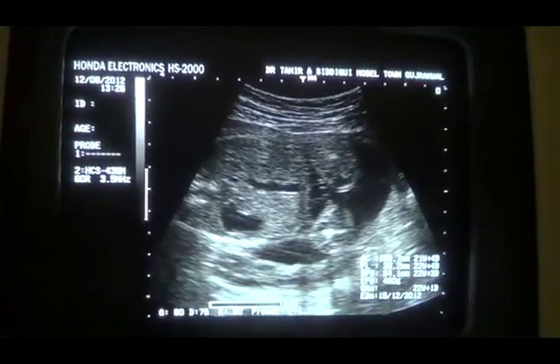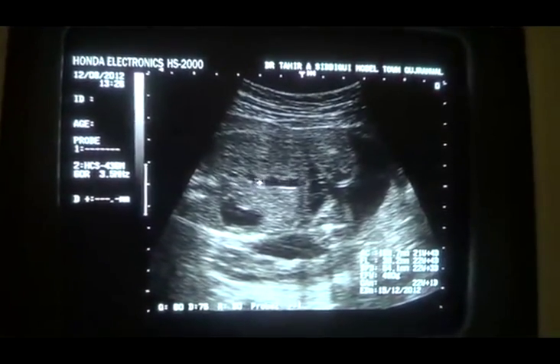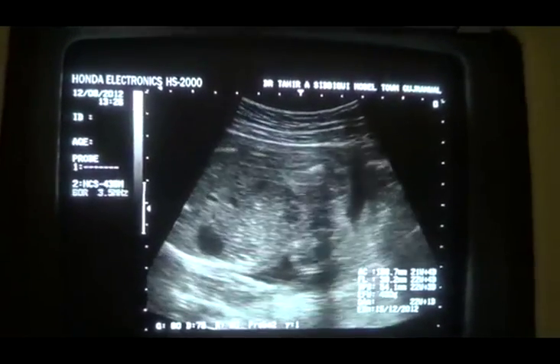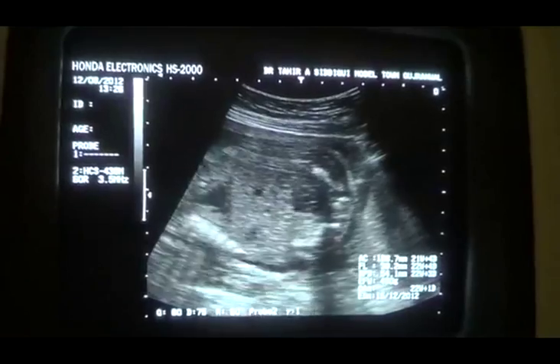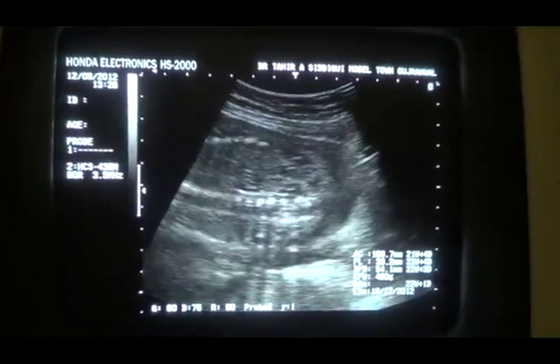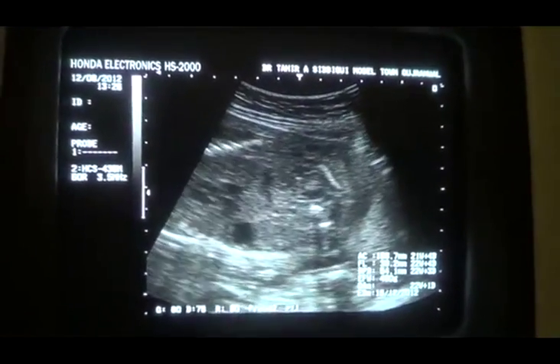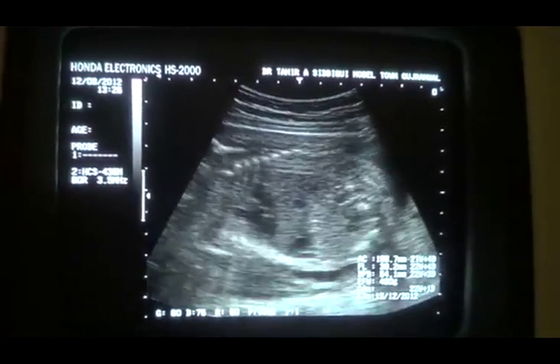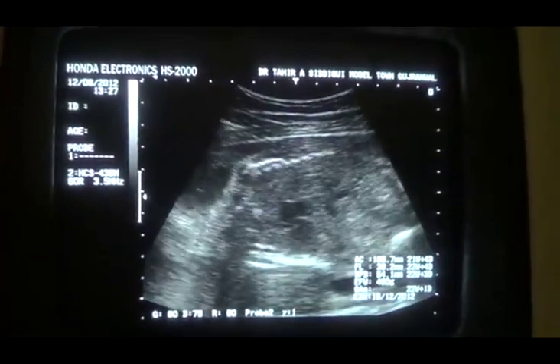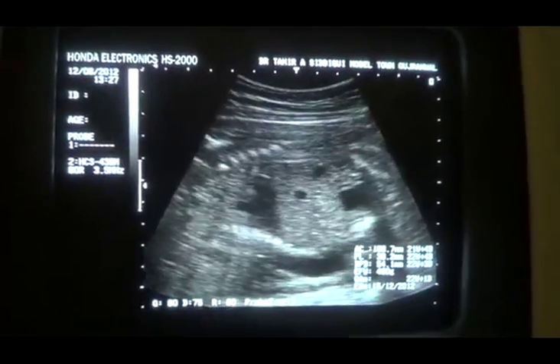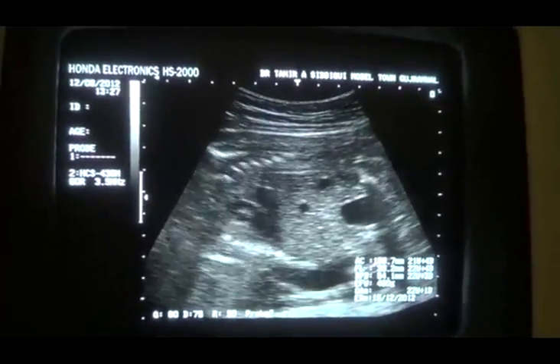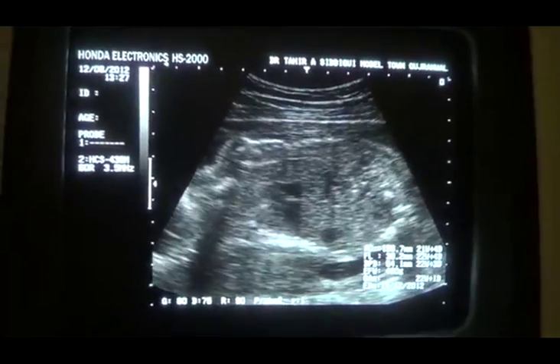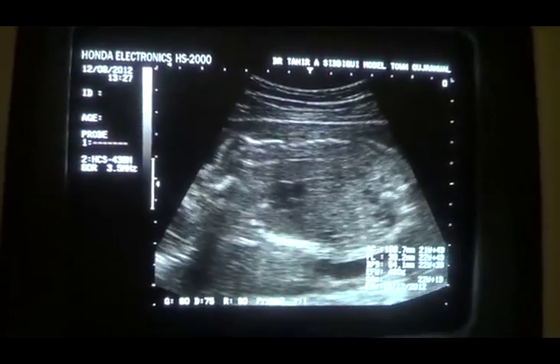This is the umbilical vein, stomach bubble. Usually the bladder is in front of you. This is the fetal body. So there is no malformation.